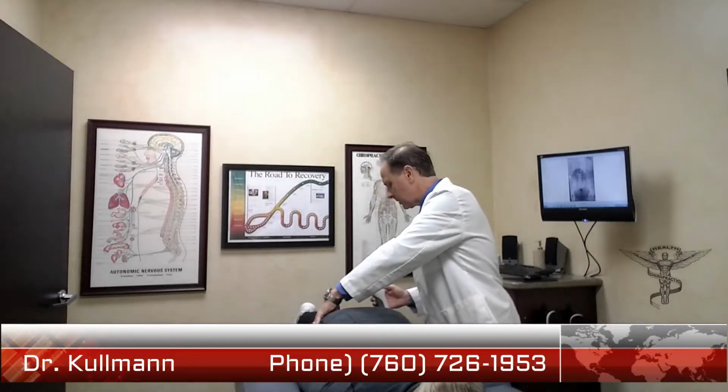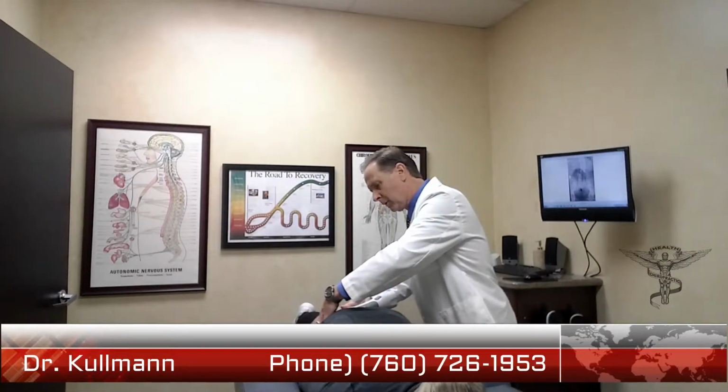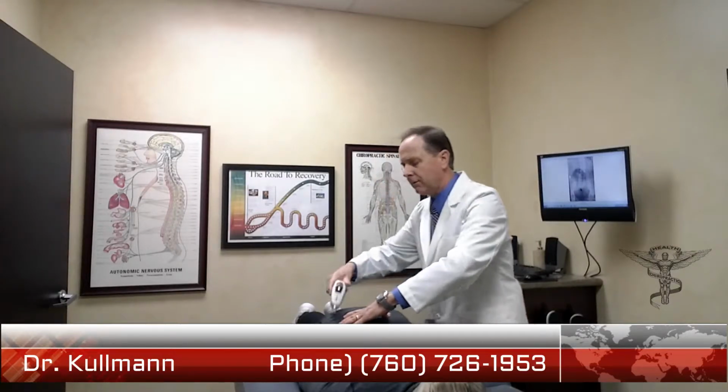So we notice on Tori that she has what we call a pelvic deficient side on the right pelvis, and we're just going to confirm that that pelvis is out of alignment. And when we pressure test or force the joint into a normal direction and it balances out the leg lengths through a series of neurological reflexes, we know we're on the right spot. So we're going to utilize the Activator 5 instrument to make our adjustments. The first one is we're going to adjust her pelvis. And we're going to adjust her pelvis forward utilizing the Activator instrument. And we use the force setting that's appropriate for her back.